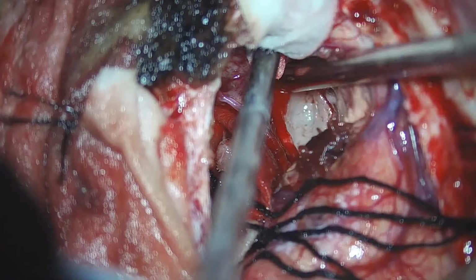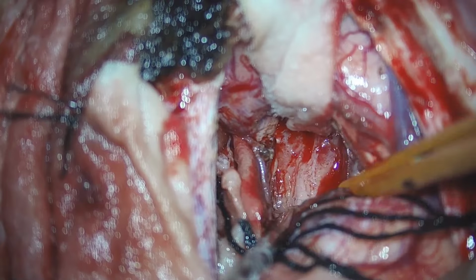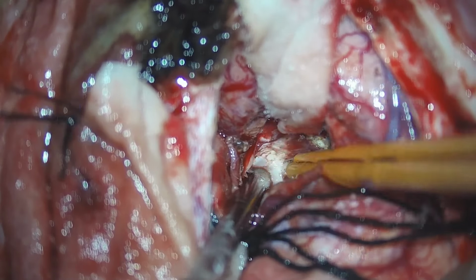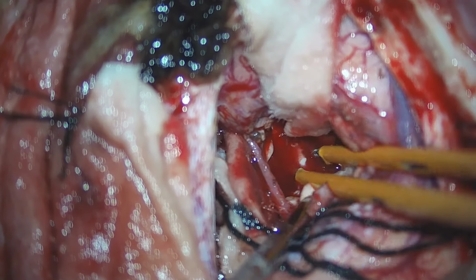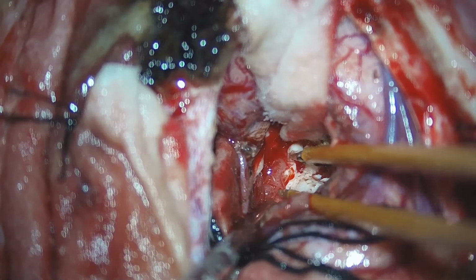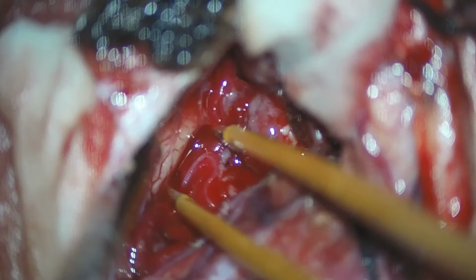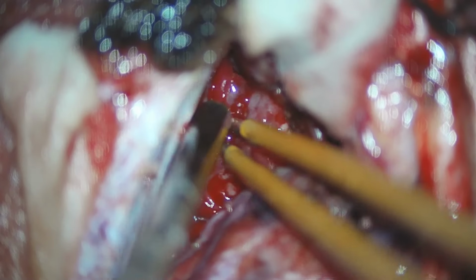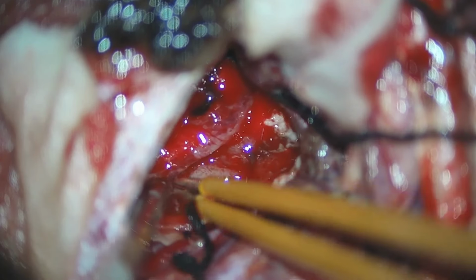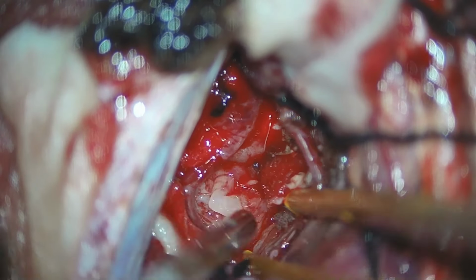Now, after the adequate debulking, we are again trying to create the plane between the tumor and the normal brain. We can see the areas of normal brain being visible through the tumor bed. We can see the grayish tumor area and ivory colored normal brain here. Here the haptics, the tactile feel, is also very important to rely on for how much tumor is being removed and how much normal brain we encounter.